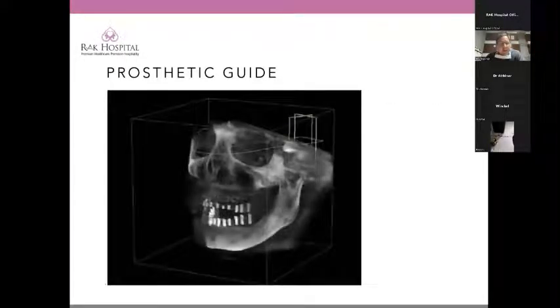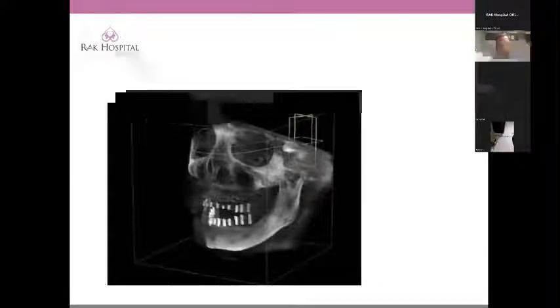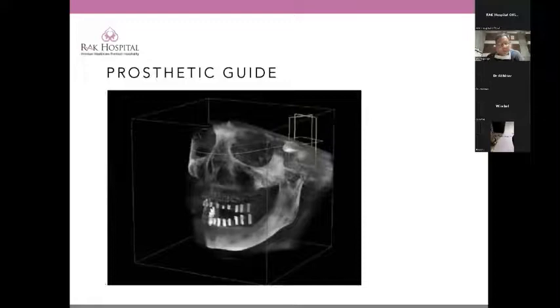Initially, this is how the guides were planned. We used to have a radiographic marker in the denture. The patient would go for a scan again, so again, double radiation. Then, looking at those radiographic markers, we looked for appropriate places in the bone where the bone is available, and then guides were made. Now everything is done mostly in one single step.